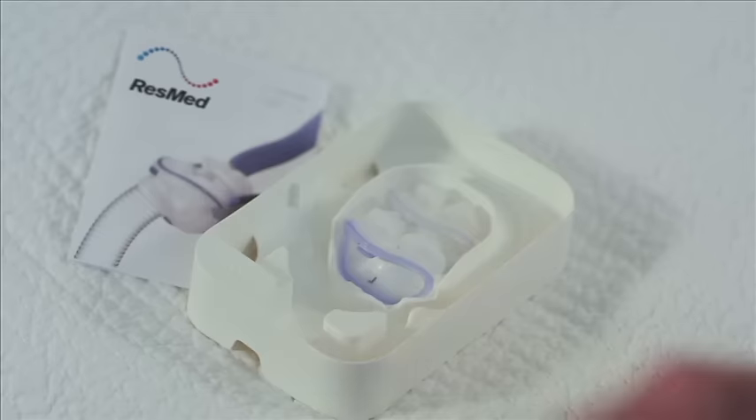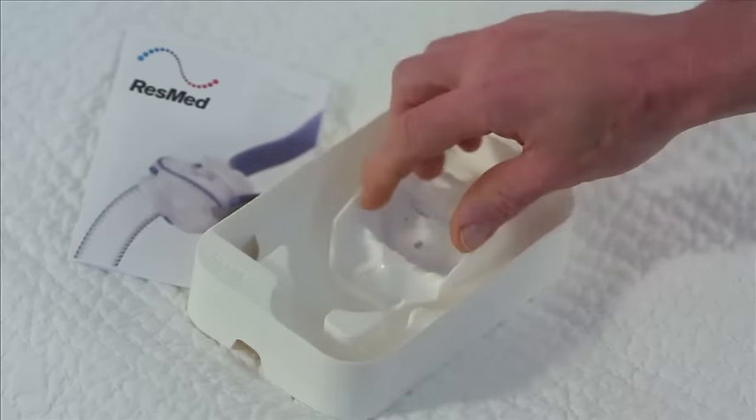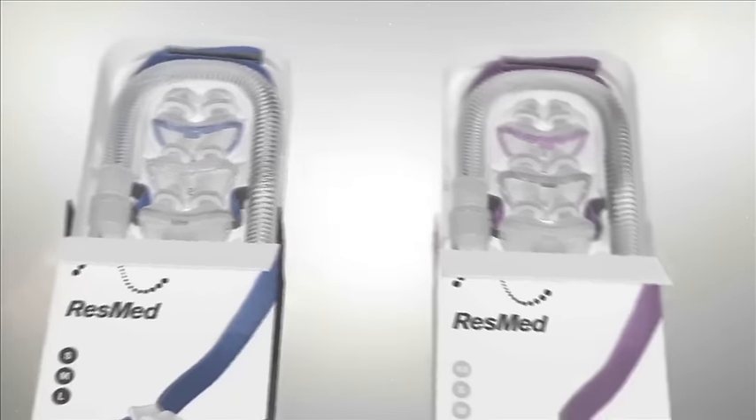If the pillows in your AirFit P10 are not fitting well, they may not be the best size for you. Included in the pack are two others to try that may fit your nostrils better. If in doubt, consult your physician to review the sizing of your mask. Your home medical supplier can also provide valuable advice.